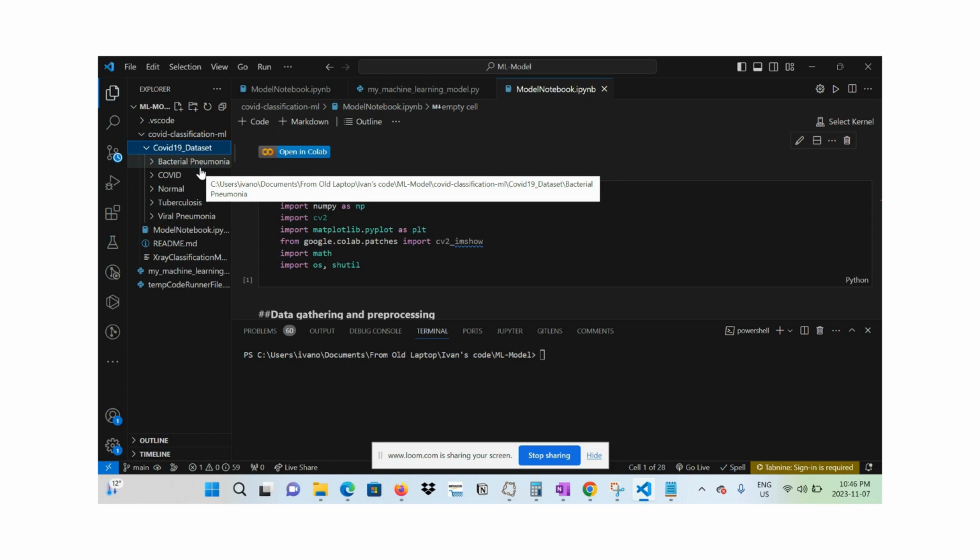So basically, currently, the model has 5 diseases for which there's a huge clinical data set, which has been verified by clinical professionals. Now, these data sets are labeled. That's where annotation comes into play. Think of Scale AI, a data labeling company that labels the data sets. But the data that's labeled in this scenario is medical images. So the whole development here is to use algorithms to detect diseases by training the AI to understand how we can differentiate between a COVID image versus a tuberculosis image versus a bacterial pneumonia image and others.